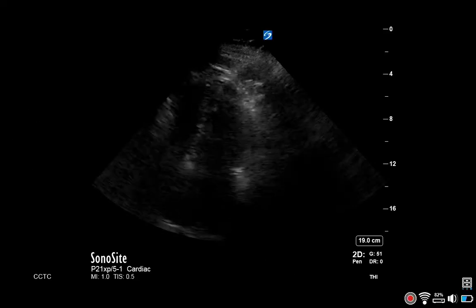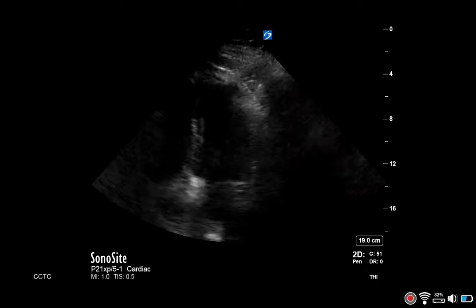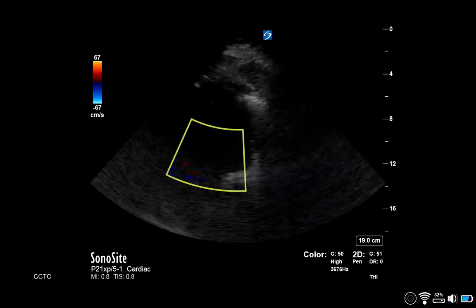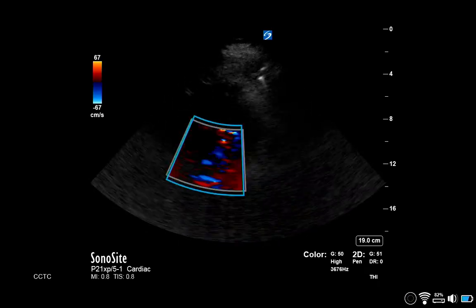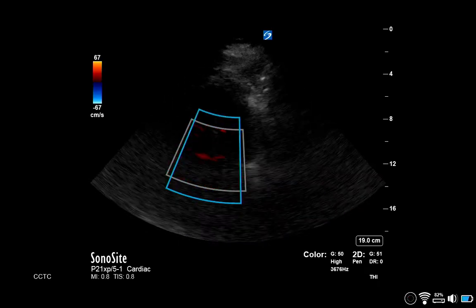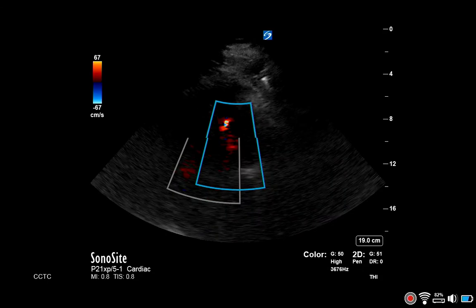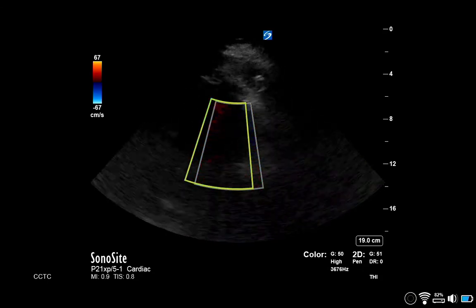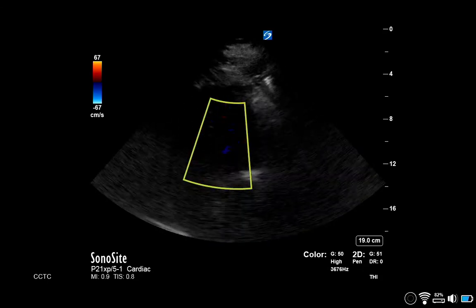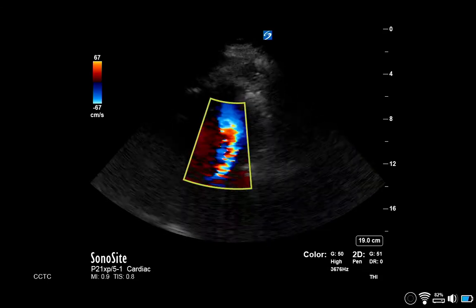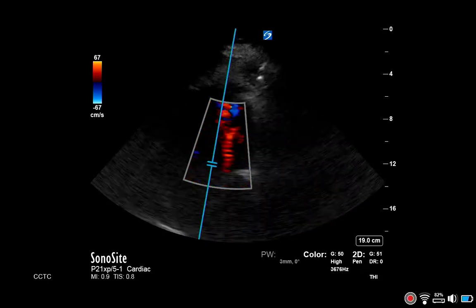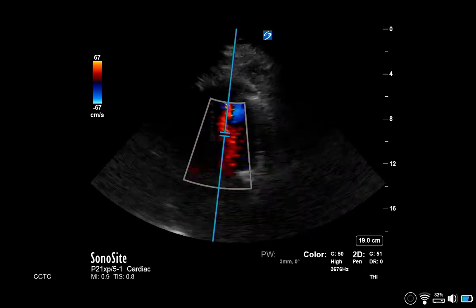Begin in the apical five-chamber view and enable color Doppler, positioning the box over the LV cavity, LVOT, and the aortic valve, screening for flow acceleration via the presence of aliasing.